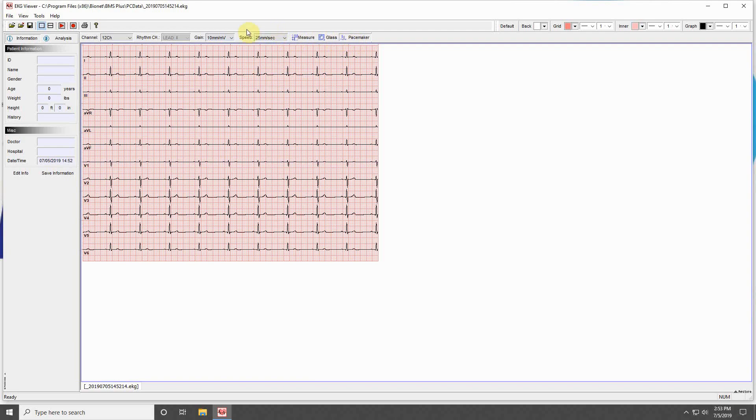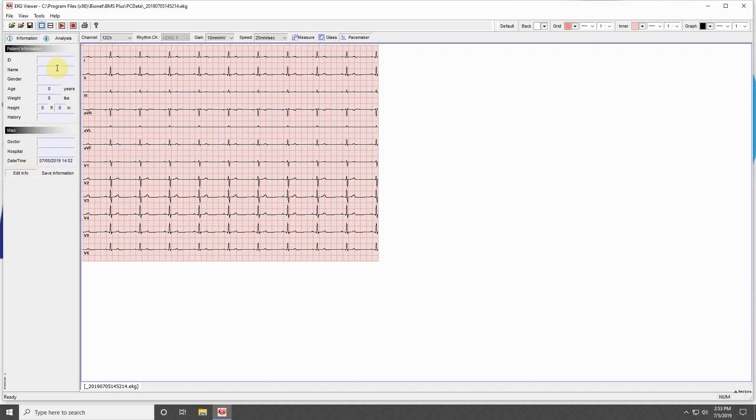The last section of the program is the customizable information fields on the left. These allow you to adjust the patient data for the file if you have not previously entered this information into your machine. Click Edit Info to input information, and save information to save it.